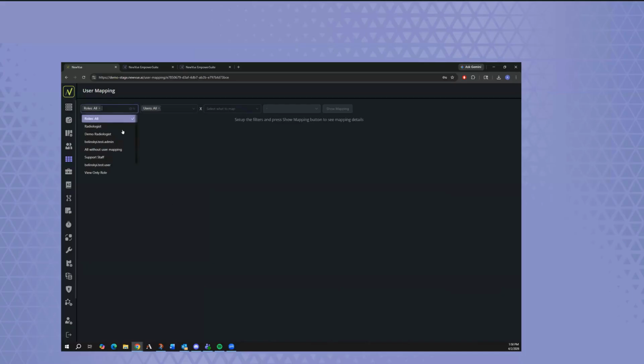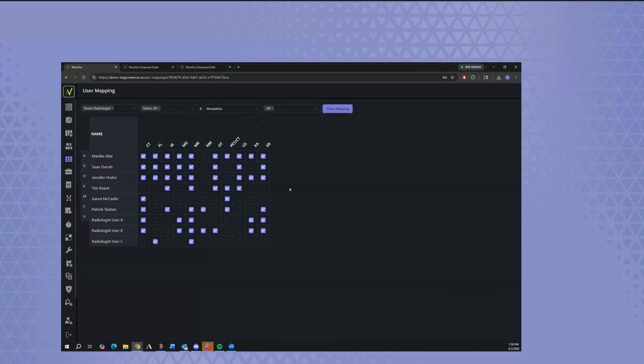But then we wanted to tackle another problem. And so this will lead us into our workflow scenario here, where I'm going to solve a very common radiology configuration problem. So to tackle this problem, and I'll turn it over for Q&A because there's lots to talk about, we wanted to make sure that when you're setting up even a very simple work list and even tackling a simple problem, you often have problems with configuration because you're trying to take into account the skill set of your staff, right?